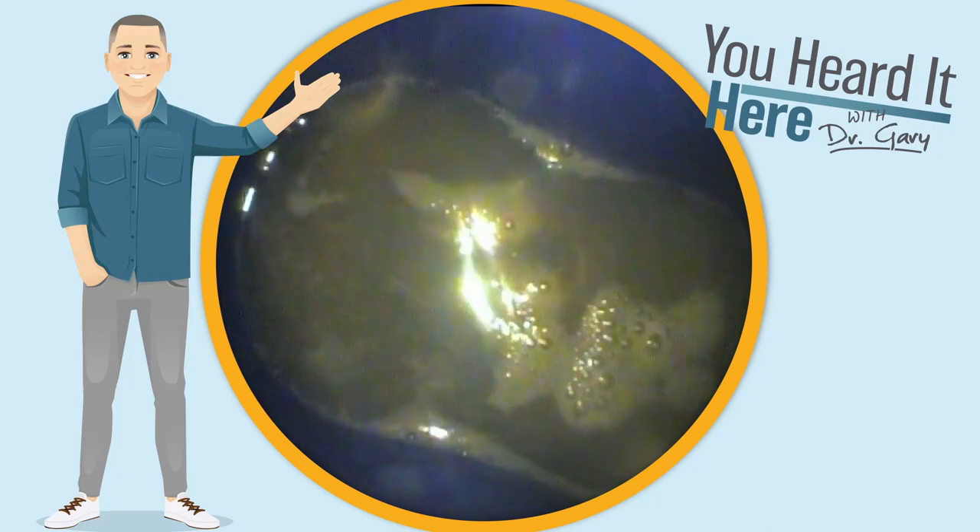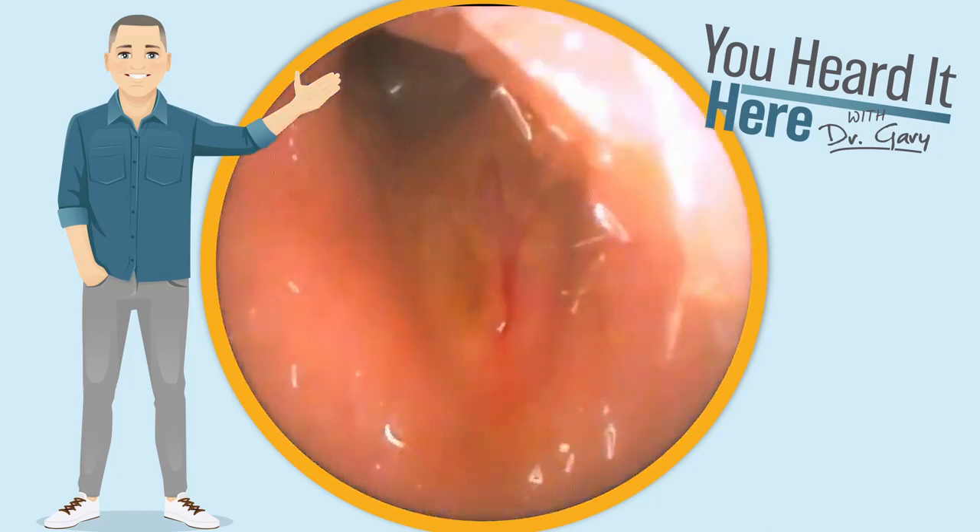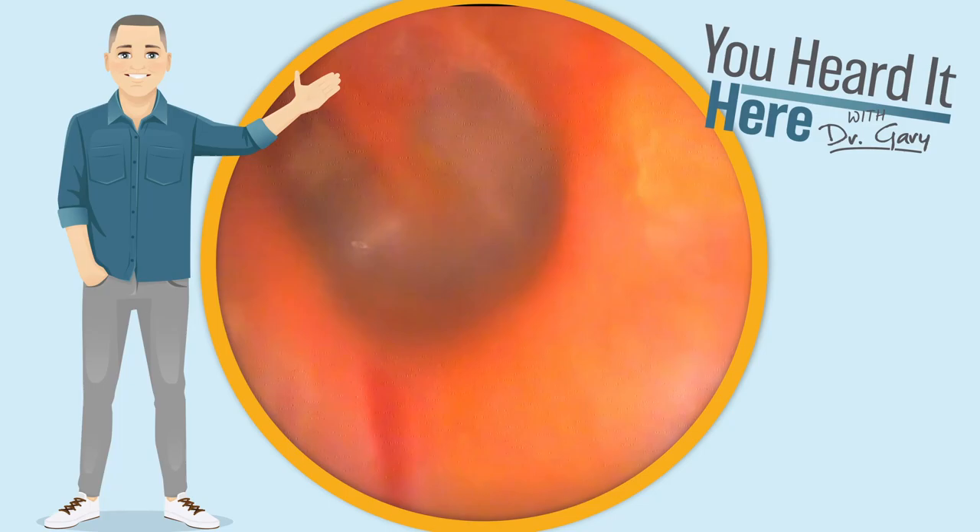This is what came out in the water. Following the irrigation, we have a little bit of redness in the ear canal, but you can clearly see that eardrum.